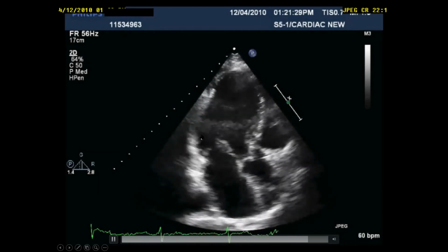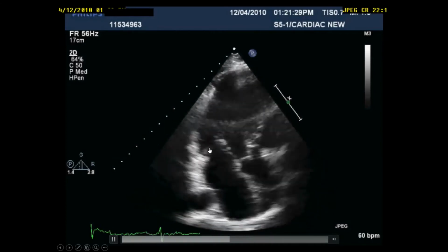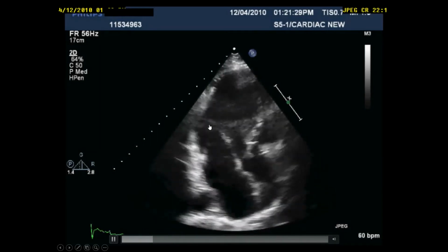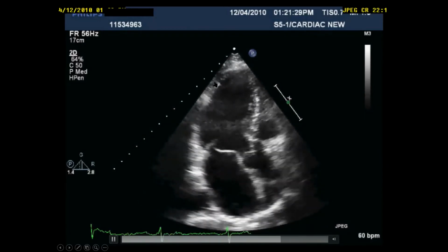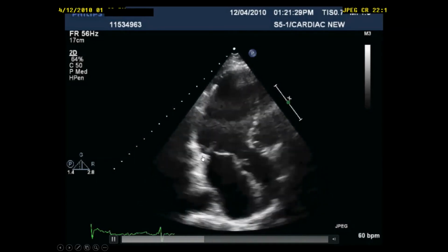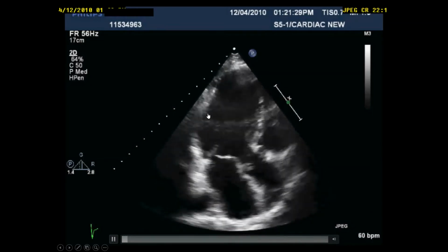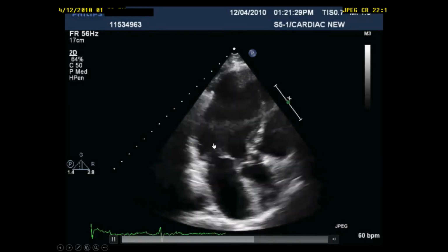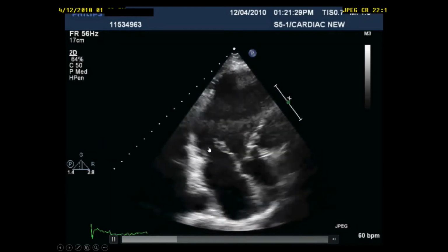So this patient has ischemic mitral valve and ischemic mitral regurgitation. The posterior leaflet is tethered because the papillary muscle is adherent to this wall, which is scarred and akinetic. That's why the corresponding leaflet is not moving well, and it is tethered downward, or apically. This patient will have MR, and the direction of the mitral regurgitation will be posterior, towards the retracted, tethered leaflet.